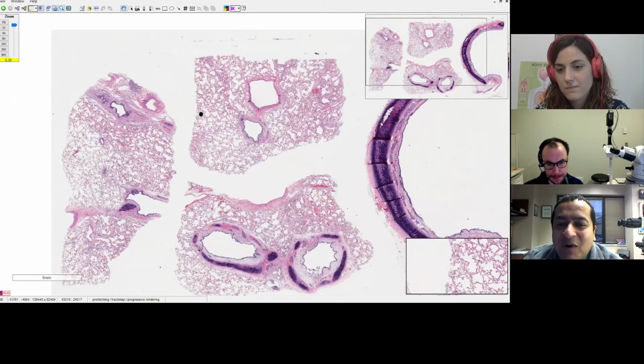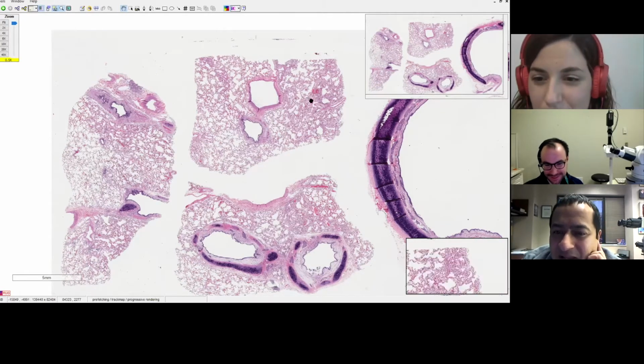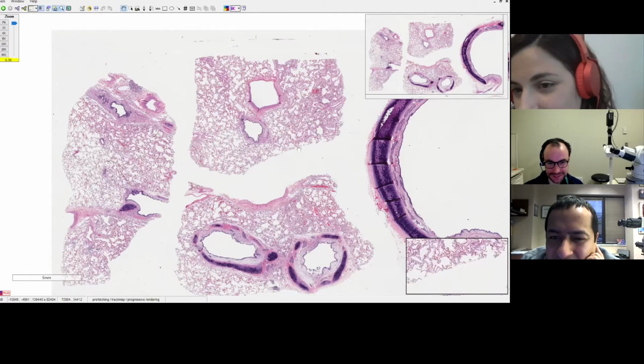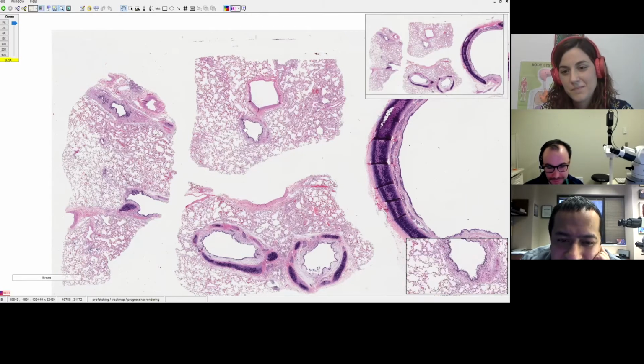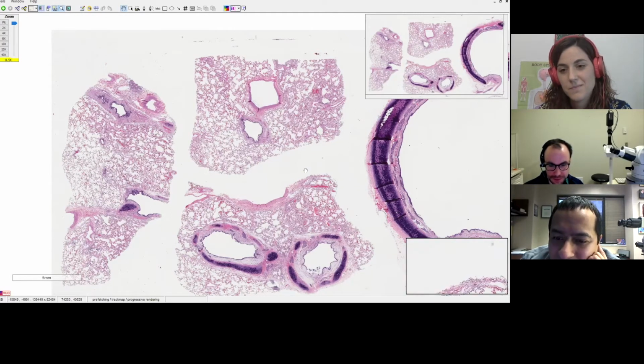And just one thing I wanted to mention, for super lung pathology nerds, is that even at this magnification, you get a little sense, very subtle, that something is wrong here in this area. It's like the difference between that, which is relatively normal, and that, where something's going on. A little bit busy. Is there something going on down here too?